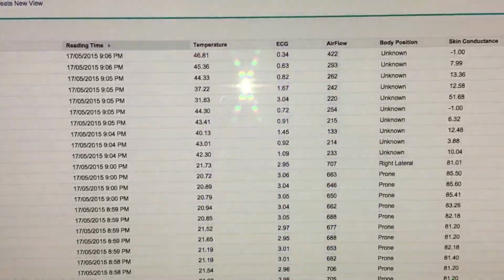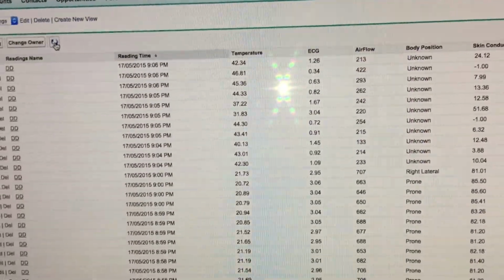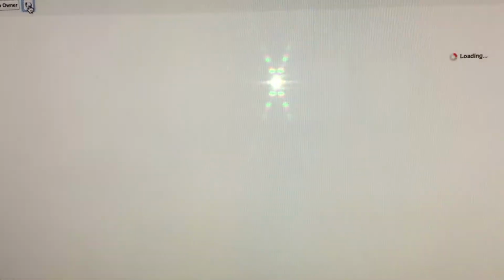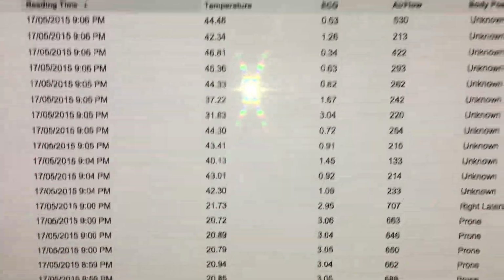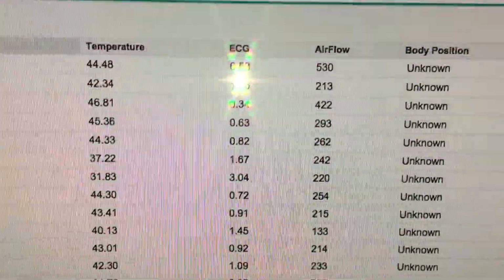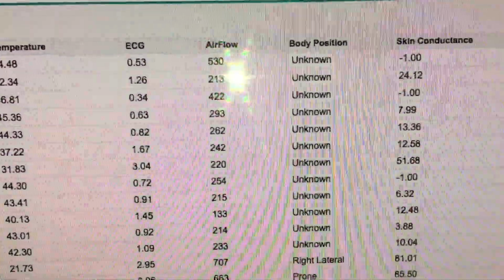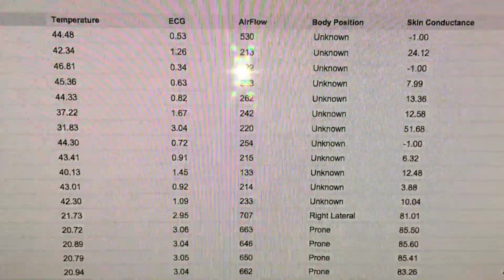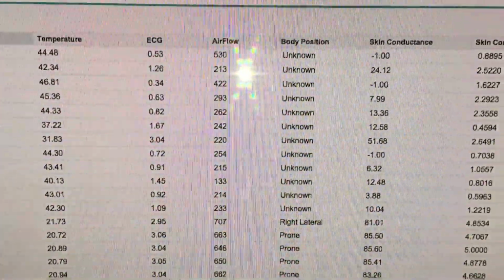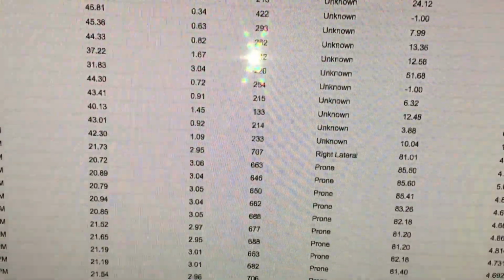What do we have now? Okay, you can see that it has picked up a fair amount of readings. I will just go ahead and do something with the body position and see if I can get that happening. It's hard when you're wired up. I've got multiple sensors on me, as well as trying to get hold of this body position sensor. Anyway, you get the gist of it.